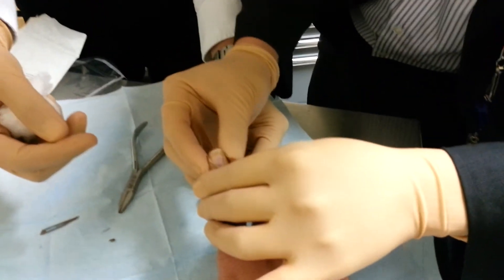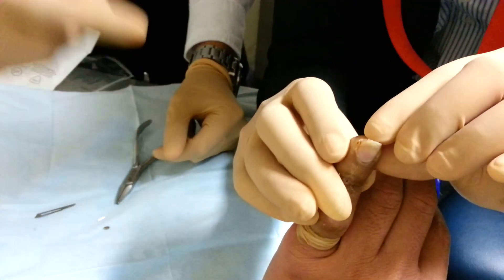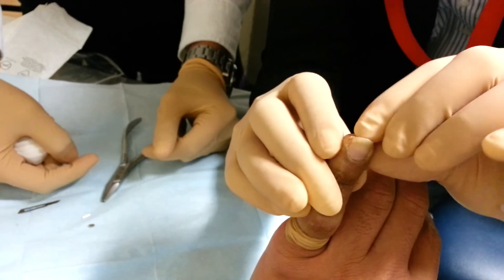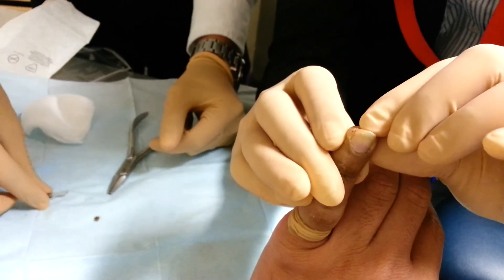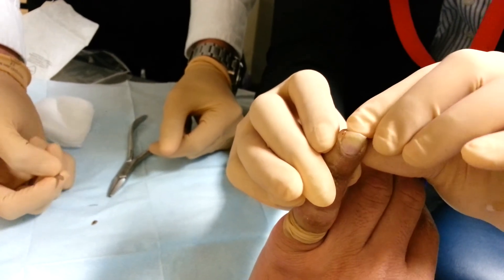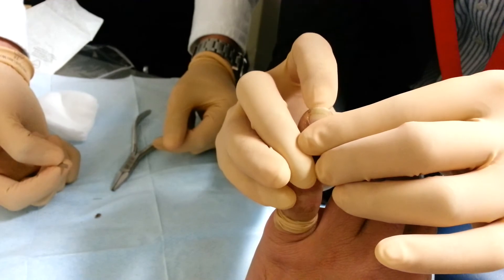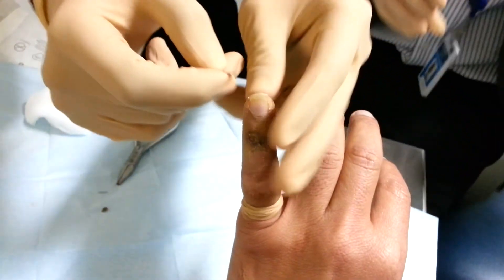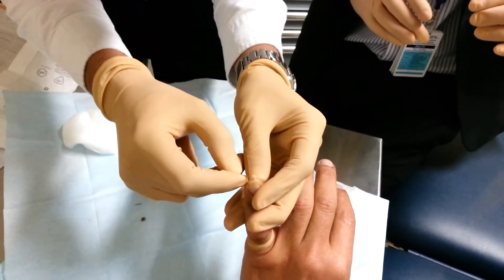You want me to turn my hand around? No, we're good. Alright. See right there? Yeah. It's cool. Yeah, it's right there. Yeah. Interesting. What is it?